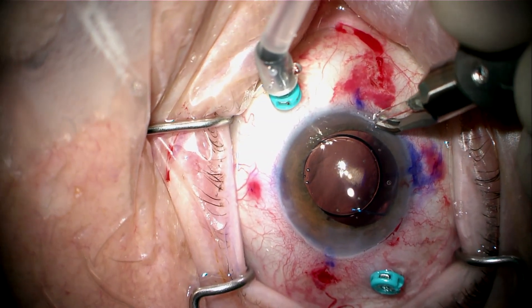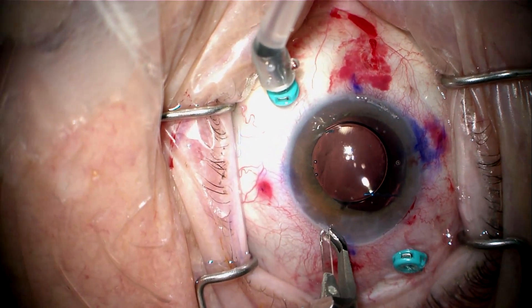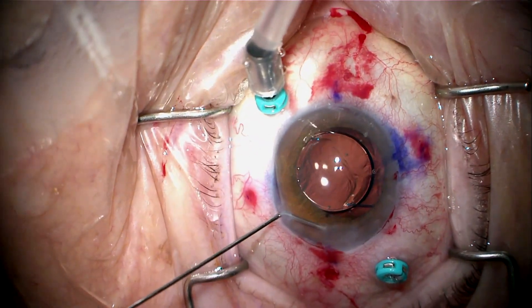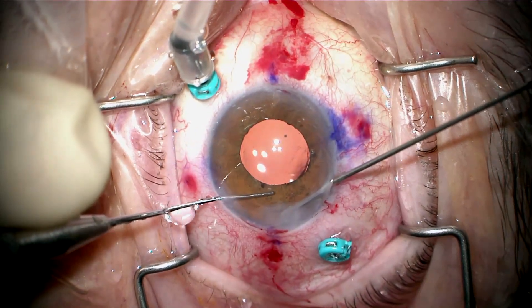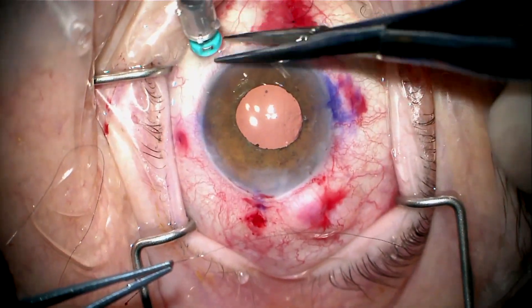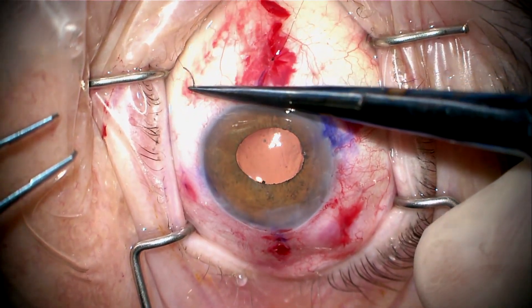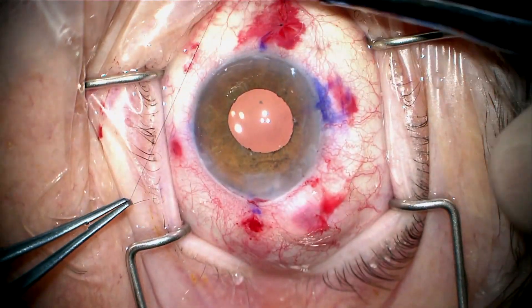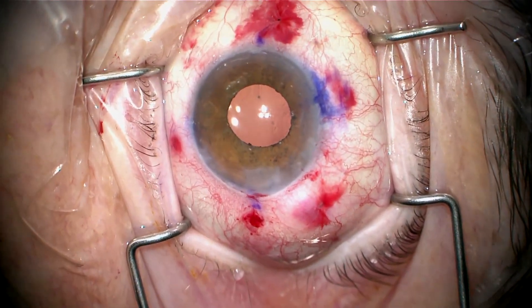With the infusion on, I'm going to place LRIs to reduce her astigmatism as measured on the cornea prior to surgery — this will improve our uncorrected vision. We inject Miochol to bring the pupil down and place a peripheral iridotomy with the vitrector to prevent reverse pupillary block, then remove the trocars. I do want to suture this sclerotomy to make sure there's no leakage, which could lead to hypotony — which I really don't like in these very big eyes. I rotate the suture into the sclera and the case is completed.